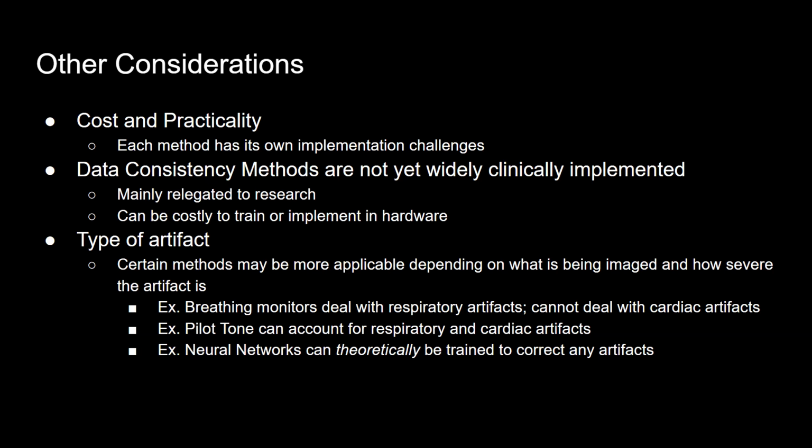If you, for example, are just expecting to deal with a respiratory artifact, maybe you can get away with a navigator or a breathing monitor. But for more complex types of motion, such as rigid body motion, you would need something more complex. And last slide, which method is best? As we've seen in this class, it depends.